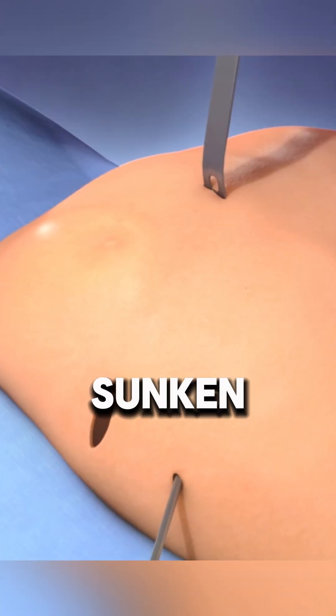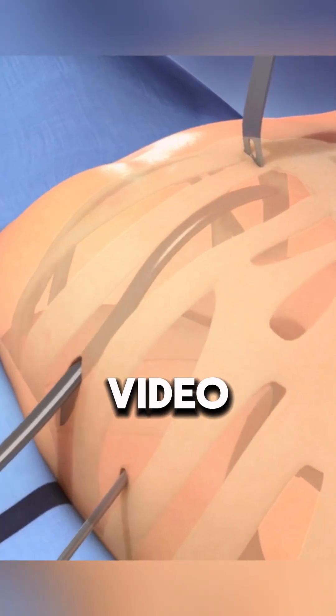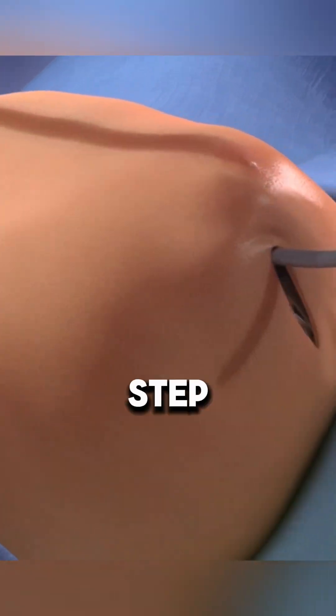Ever wondered how doctors fix a sunken chest? Save this video to learn how pectus excavatum is corrected step by step.